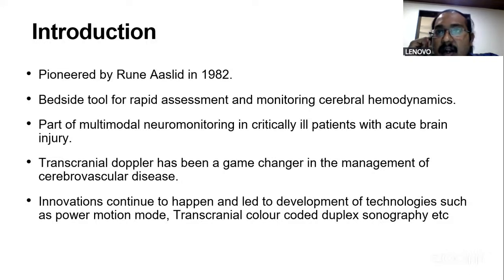Aslid's main thought was to identify vasospasm before delayed cerebral ischemia or infarct occurs. It has applications in many other cerebrovascular diseases, and innovations such as power motion mode and transcranial color-coded duplex sonography have improved it.